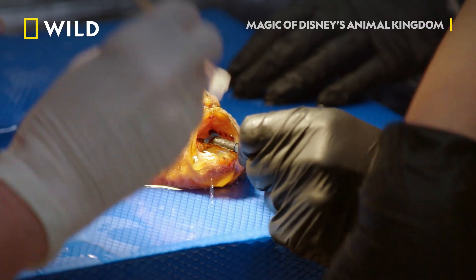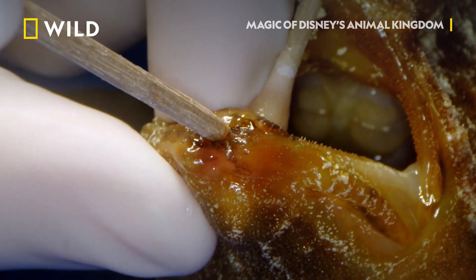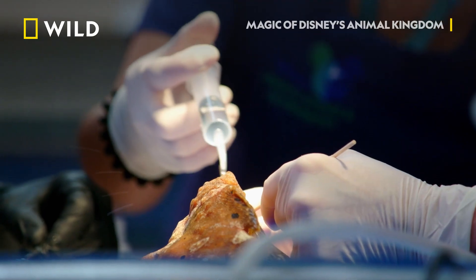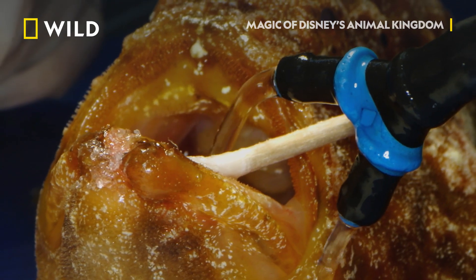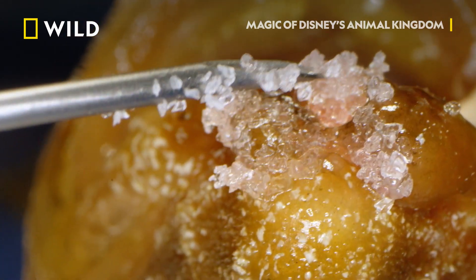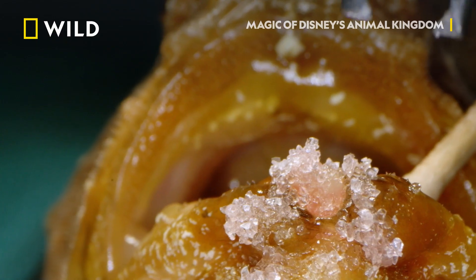Dr. Natalie prepares for a procedure usually performed on a much different species. I'm going to be exposing the bone. I'm going to scrape the bone a little bit. And I'm going to put these really cool crystals in, which they use in humans for their dental implants, that are going to help stimulate growth in order to get that to solidify. Dr. Natalie packs the bone graft crystals onto Pumpkin's jaw, just a few millimeters thick.